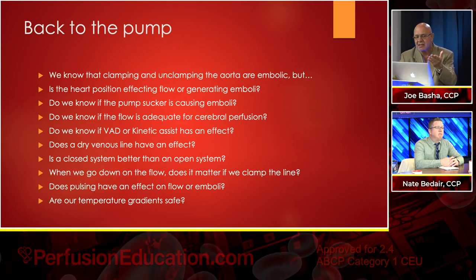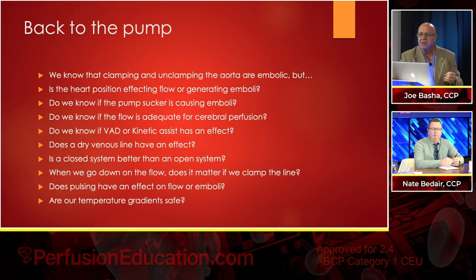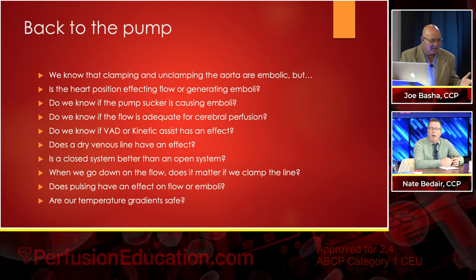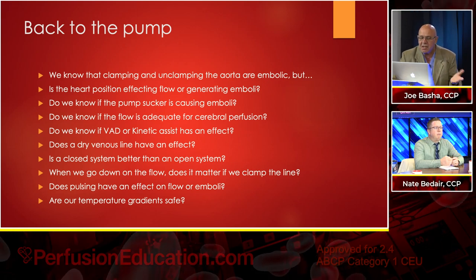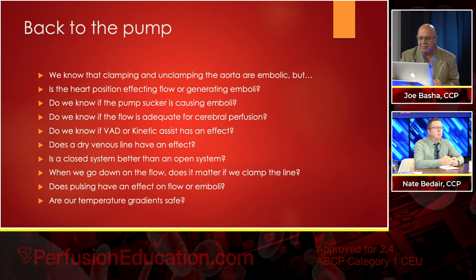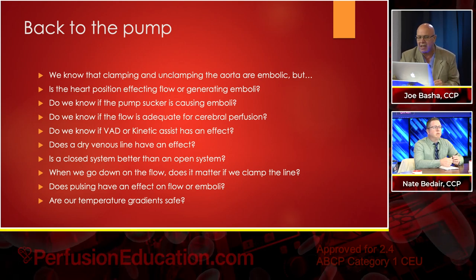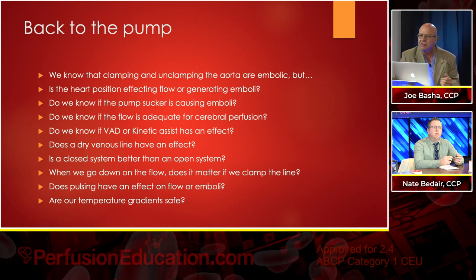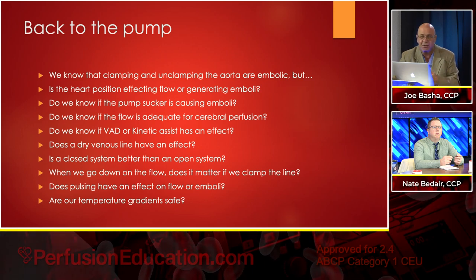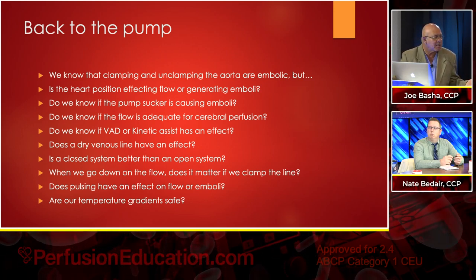Oh, I know what I was asking in that first one. Is the heart position affecting flow? In other words, are we flowing well enough to the brain? Right. I think that's where I was going with that. Do we know if the flow is adequate for cerebral perfusion? Do we know if VAD or kinetic assist has an effect on embolic events? Does a dry venous line have an effect? If you go on with the dry venous line, reduce hemodilution. I used to do it. I did it for years. But does it generate more gaseous microemboli?